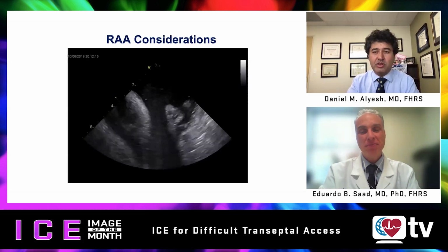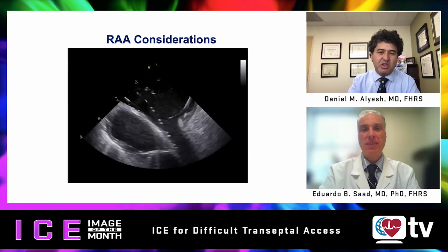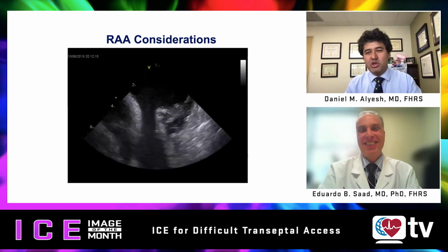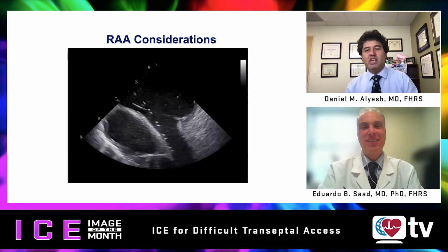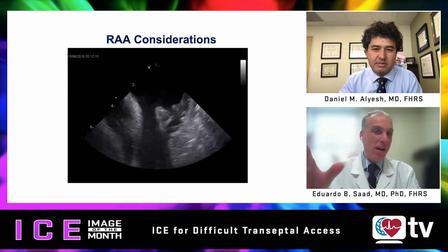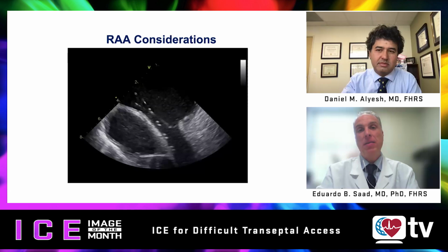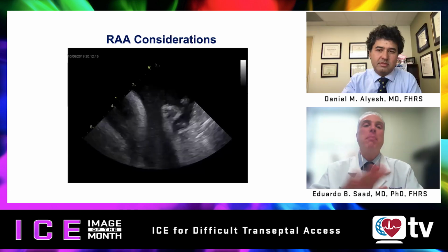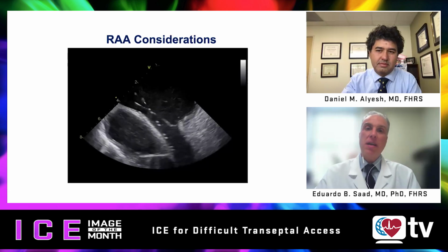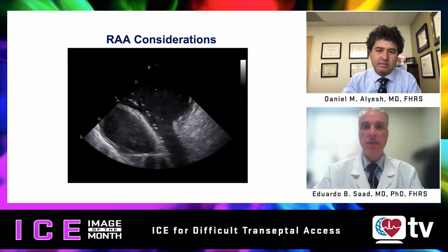No, I totally agree with you. People are probably sick of me saying this, but when you use fluoro to do these things, the heart is invisible, and we're imputing where everything is. There's no guessing game. You see everything. This is the important thing about fluoroless, and I keep saying it all the time: you can't have any blind part to it. You just have to acquire the images, and it's possible to acquire them, to be comfortable seeing everything you're doing.